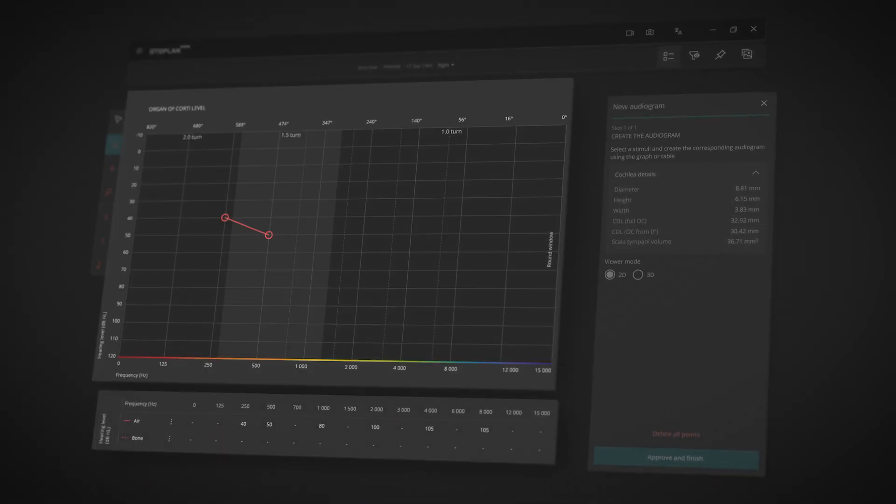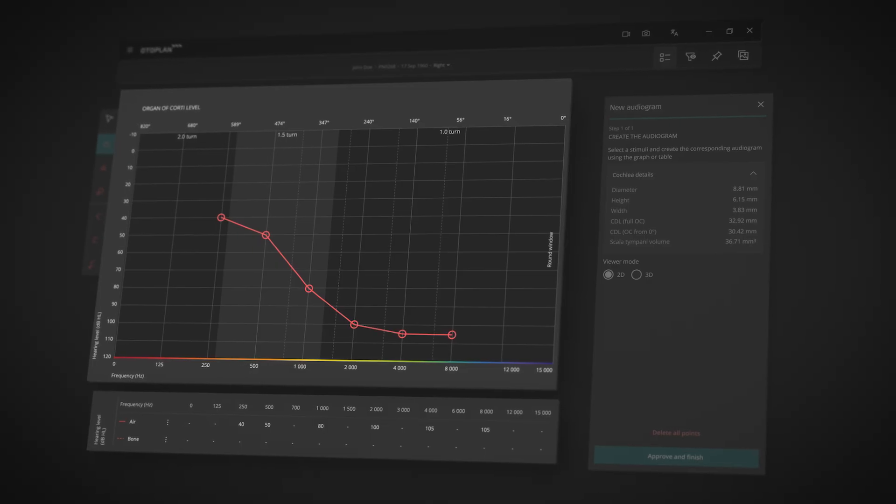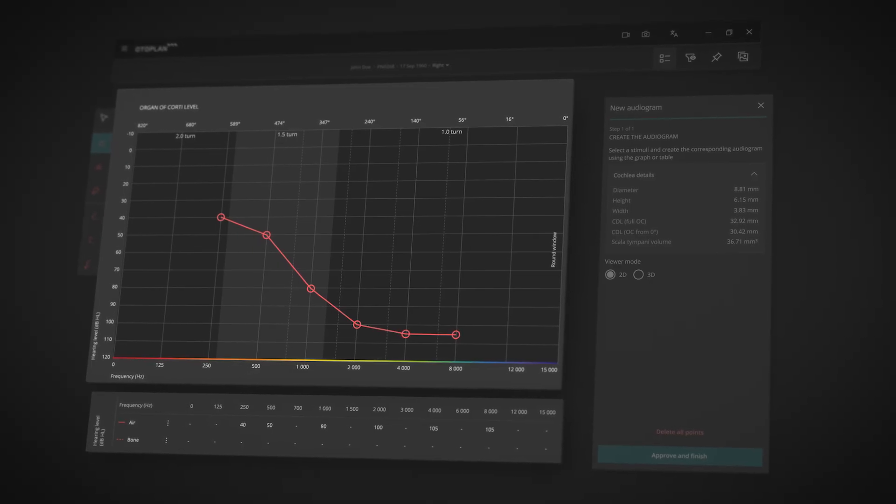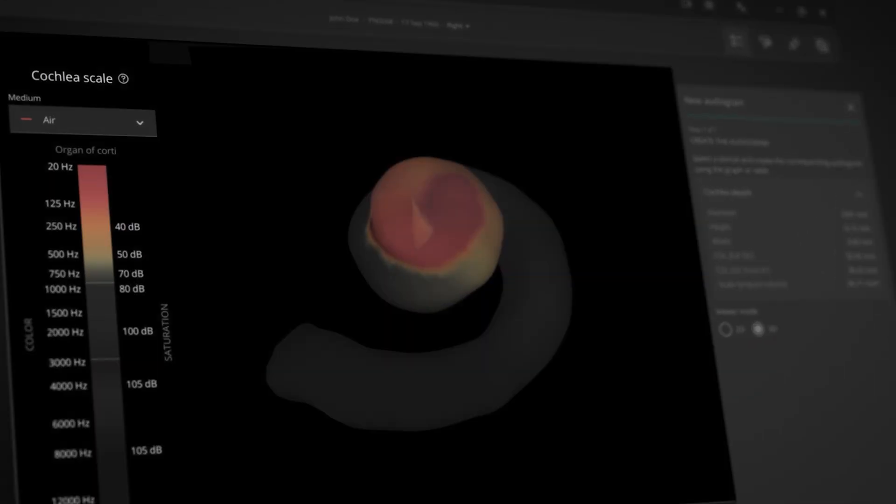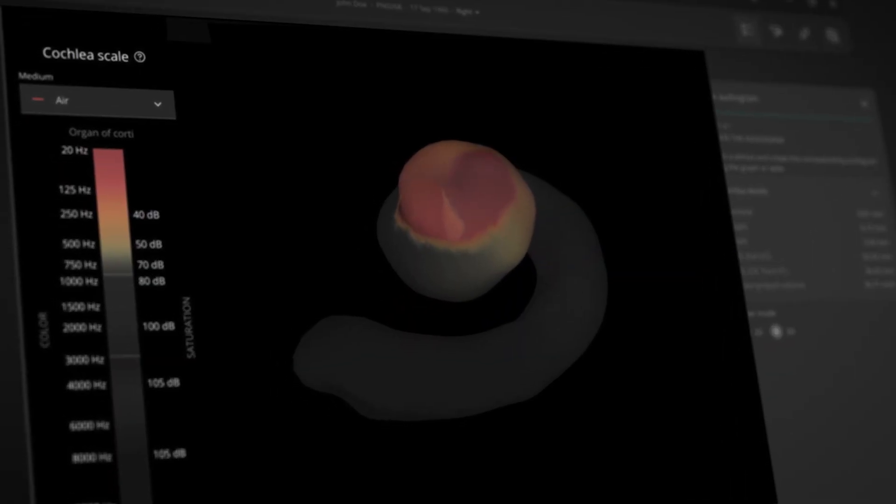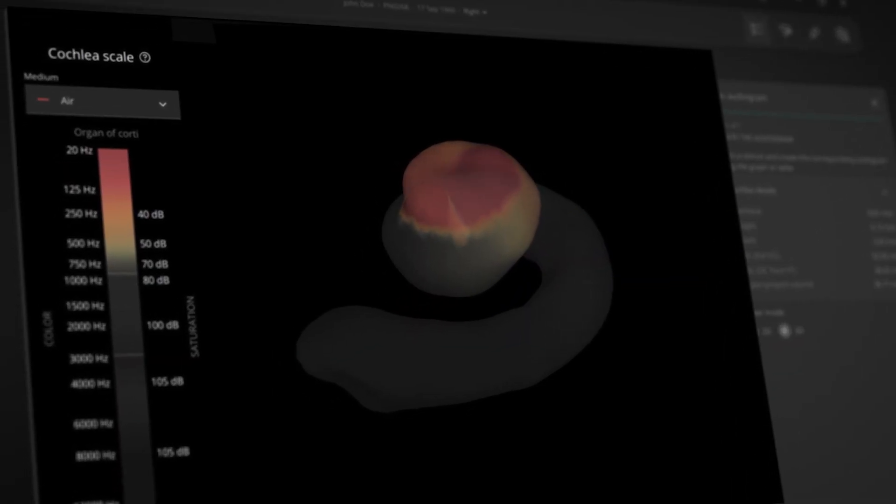And for a combined view of audiological and anatomical info, there's a 3D audiogram.